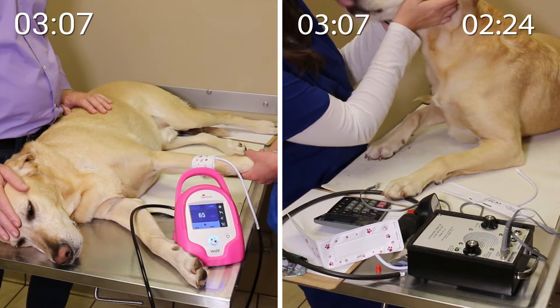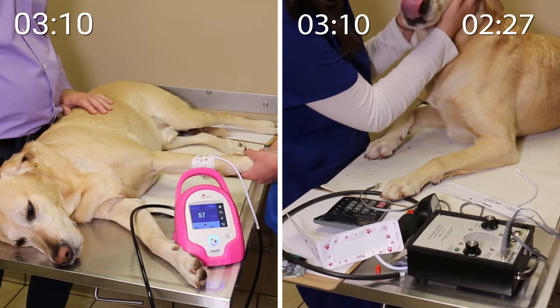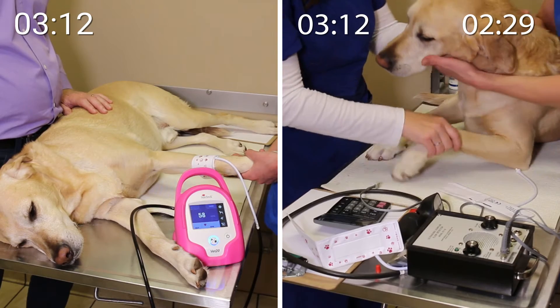Besides systolic, the oscillometric method also provides values for diastolic, mean arterial pressure, and heart rate.